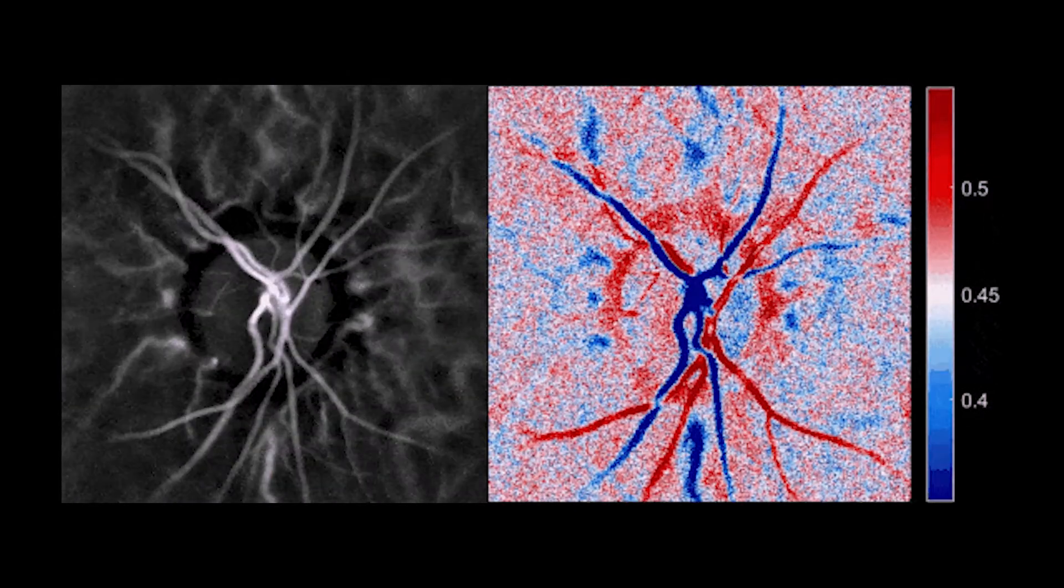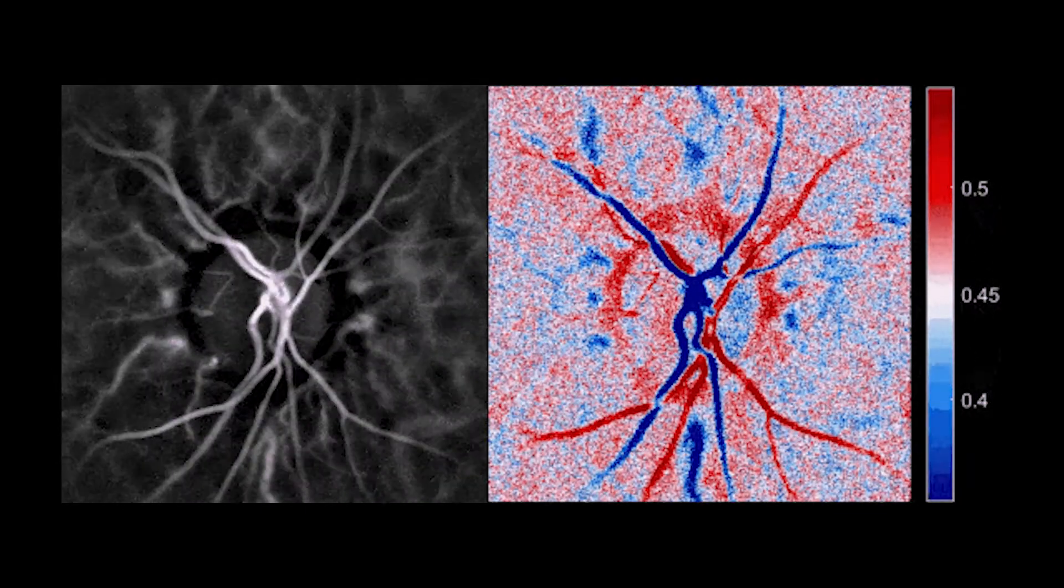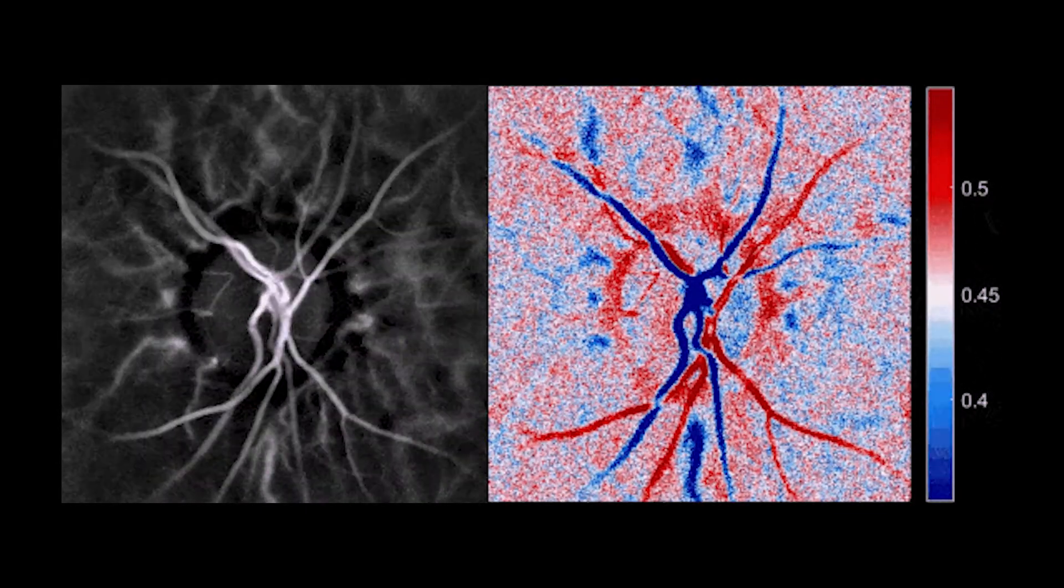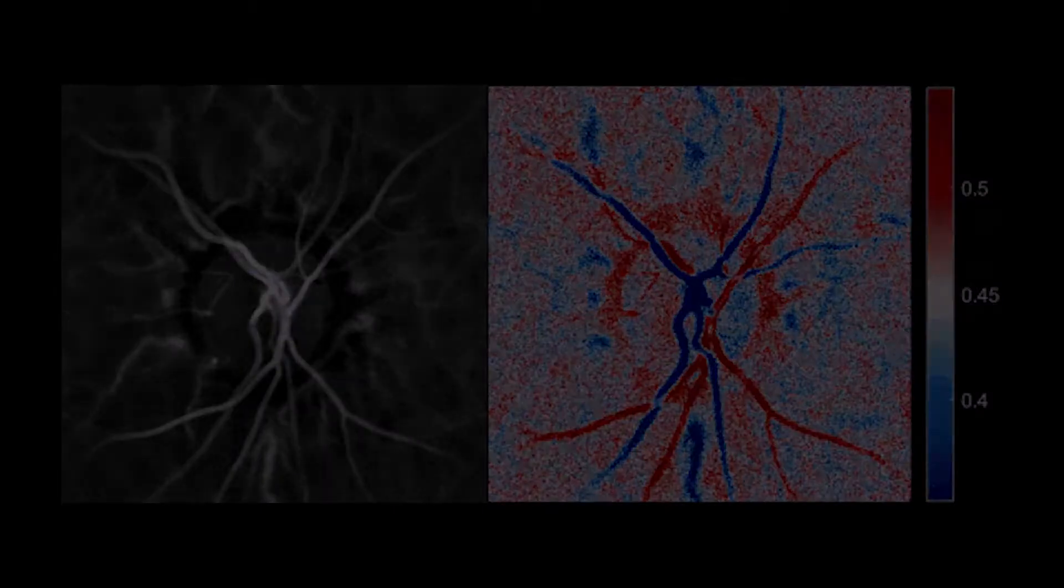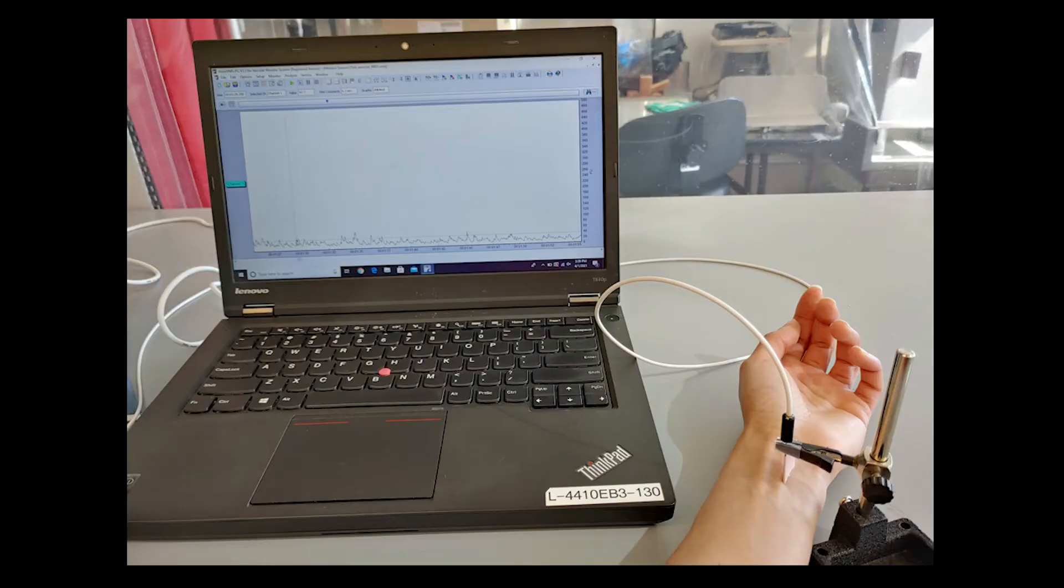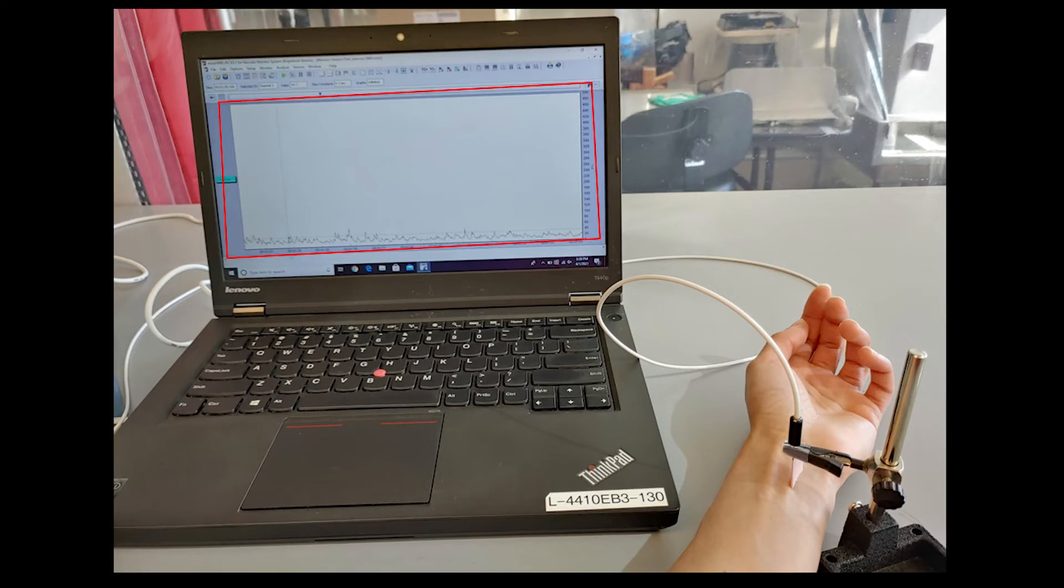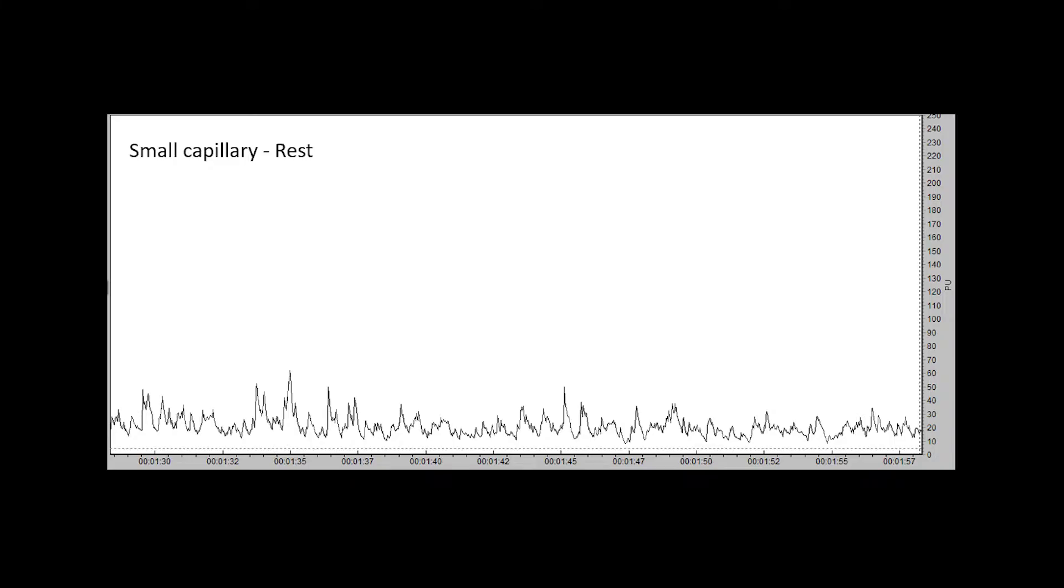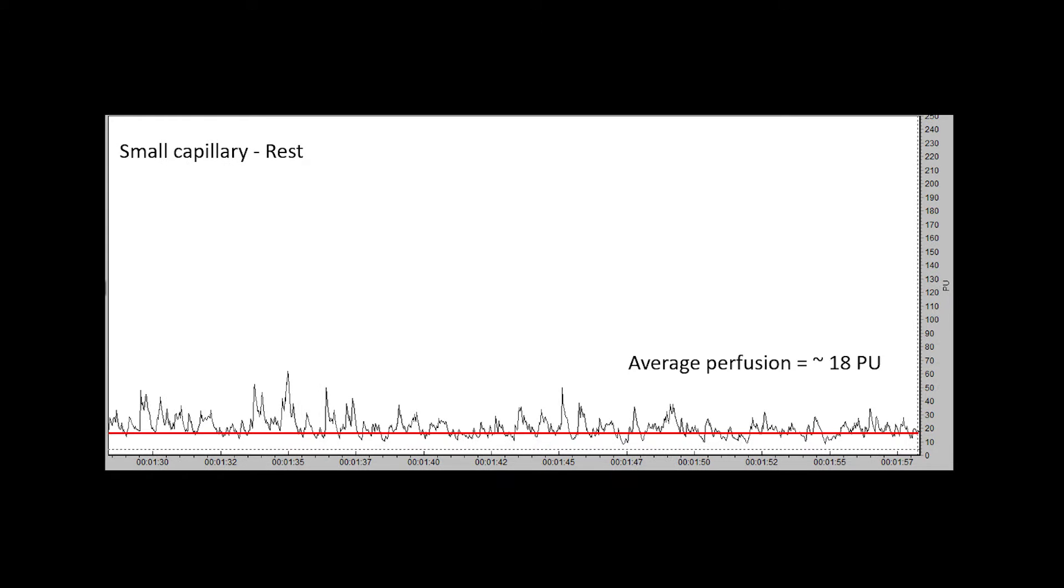LDF is useful for measuring changes in blood flow, or perfusion, after exercise. To do that, we begin by taking a measurement of a small capillary in the forearm at rest. If we zoom in on the measurement, we can see that perfusion at rest is about 18 perfusion units. These units correspond to the relative number of particles moving under the probe.